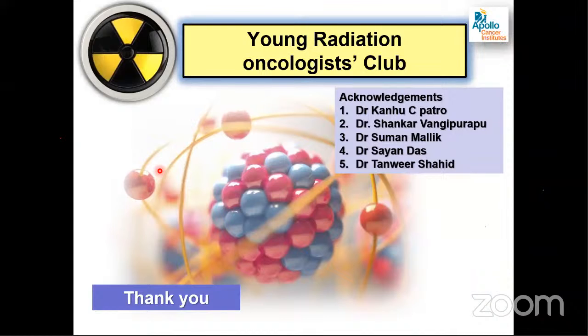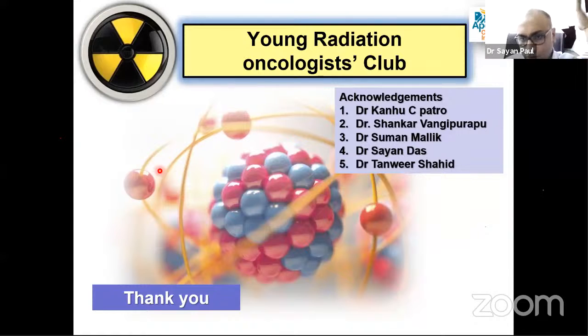So how are roll errors corrected in non-tomo machines? Okay, non-tomo machine, if you want to correct rotational errors, you should have a 6D couch. So the couch should have the ability to correct the rotational errors. Like couch should be able to move in all direction. So normally the couch moves in X, Y, and Z direction.